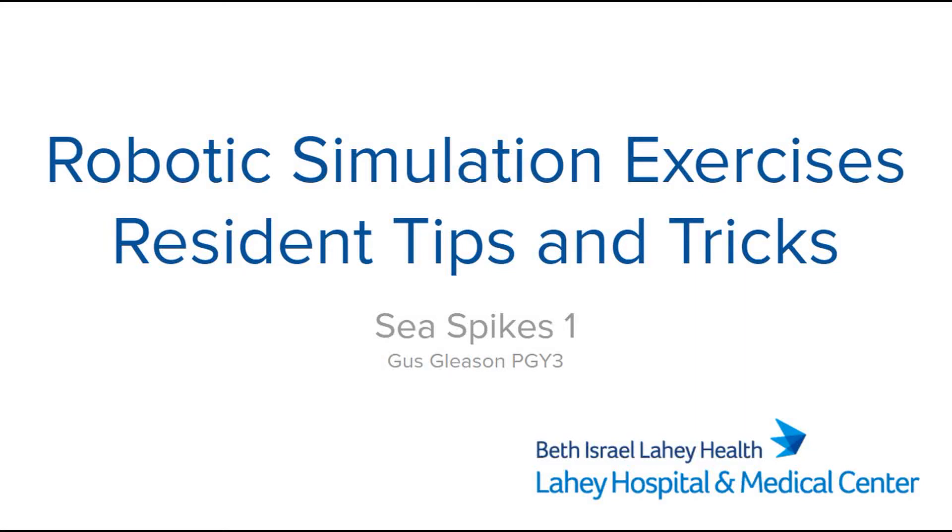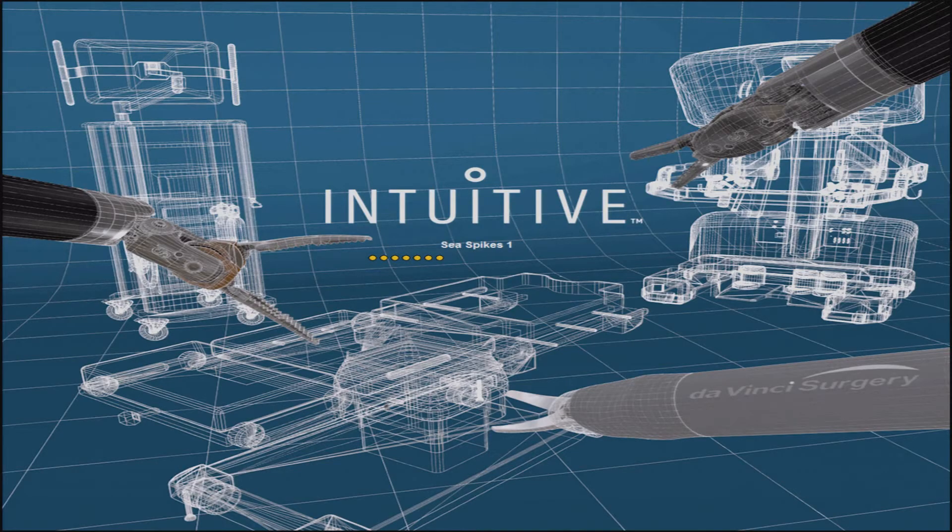This is the first installment of a multi-part video series for residents attempting to master skills on the robotics simulator. The goal of this series is to help residents improve their robotic skills by providing tips and tricks on how to ace the simulated exercises.